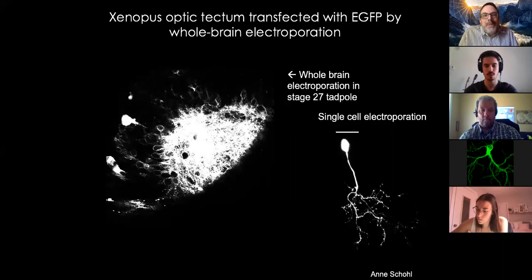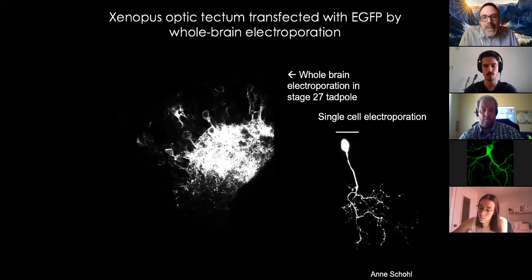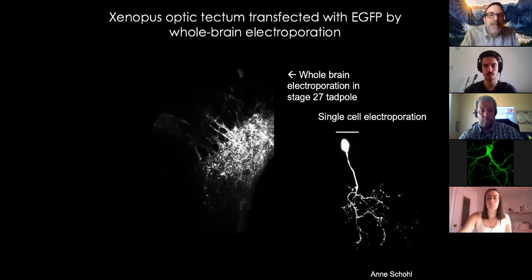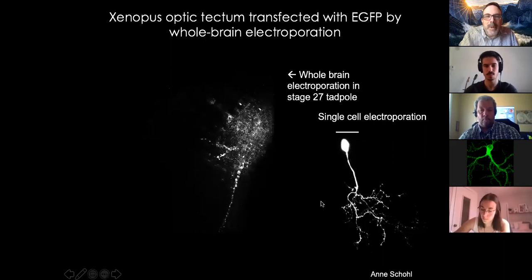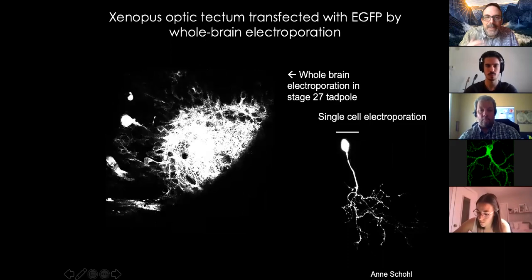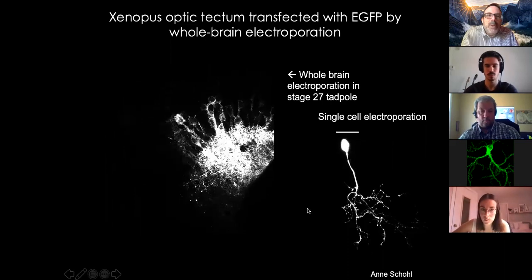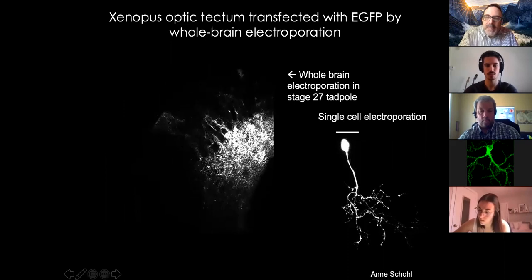And so this is the contrast of the two images. The whole brain electroporation in young animals gives really, really dense labeling of not every cell, but a large number of cells in the optic tectum. This is a two photon step through the optic tectum from top to bottom. And then this is the single cell electroporation technique on roughly the same scale. So the question is, can we take the advantages of this bulk electroporation approach and get the strengths of single cell electroporation?